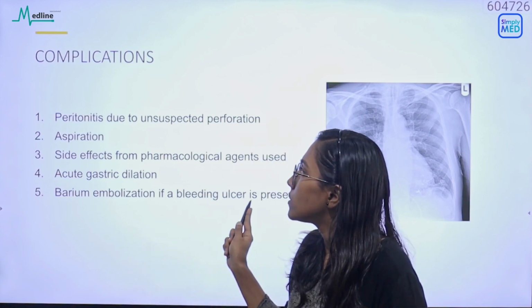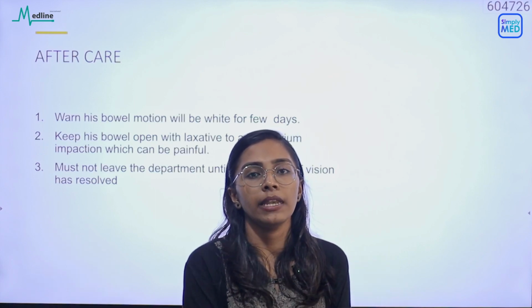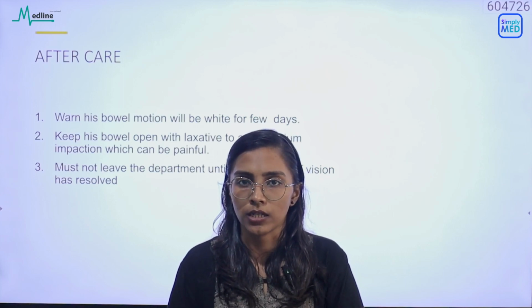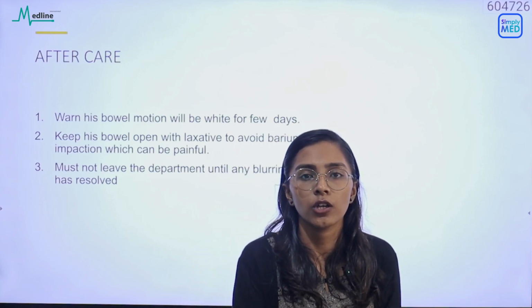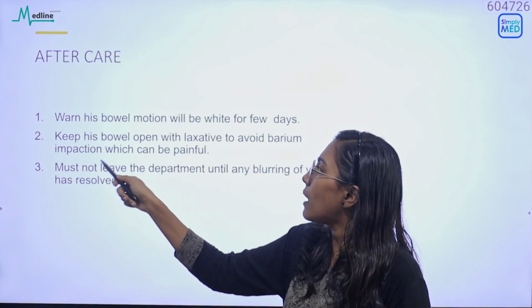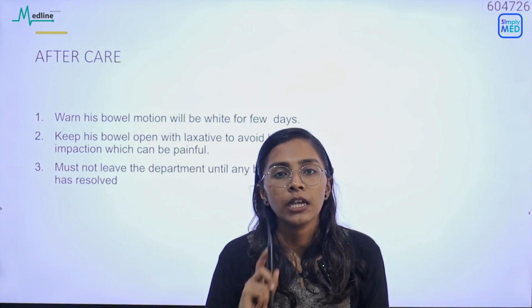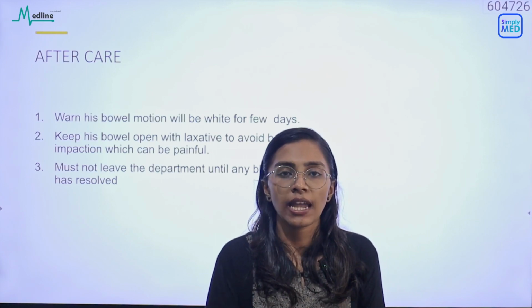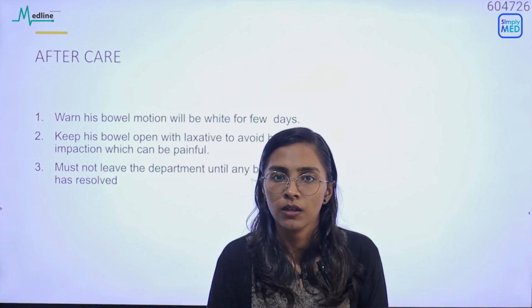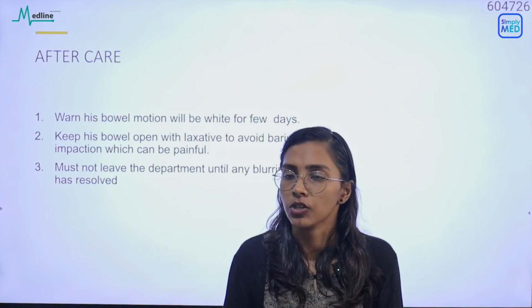After we have completed the whole barium meal study, we can give some aftercare advice to the patient. Before the patient leaves the hospital, we can warn that their bowel motion will be white for a few days. Just inform the patient that their bowel motion can be white colored for a few days because they have ingested the barium, so we can avoid unnecessary worry.